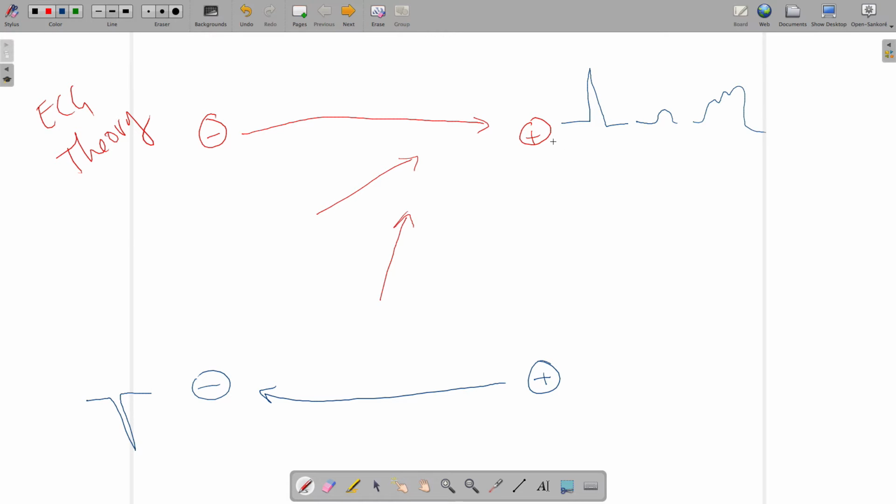Now, in a little while, we're going to tell you what those electrodes are, and we're going to actually name those electrodes so that you have an opportunity to better see exactly what it is and where it is on the body that this electricity is traveling in.